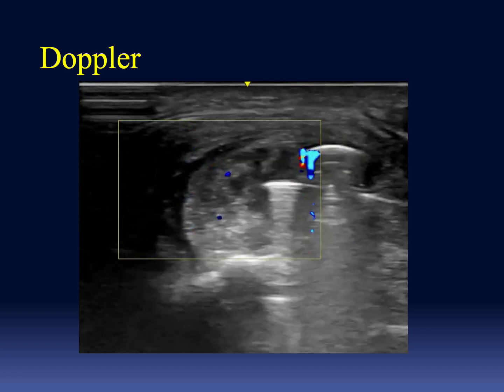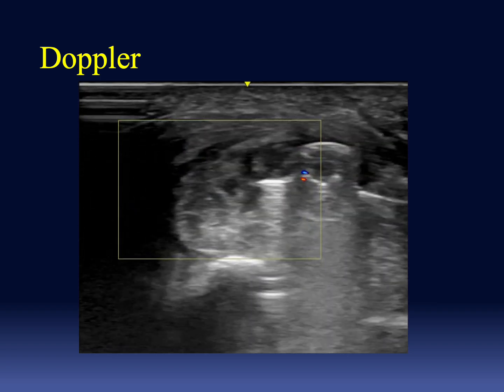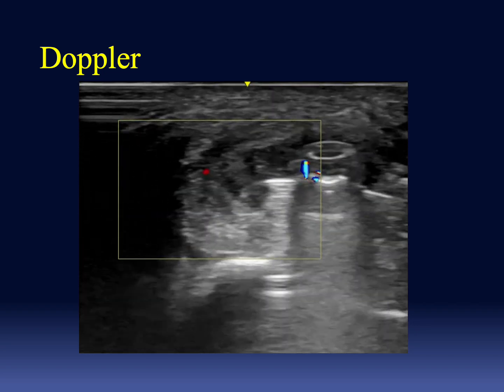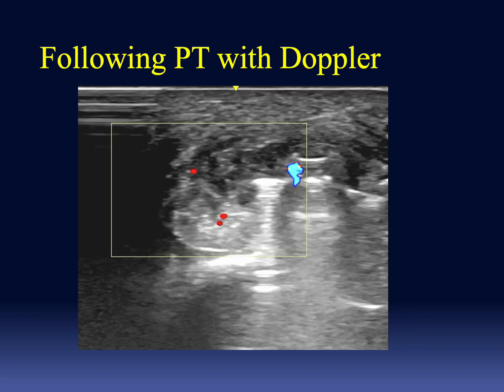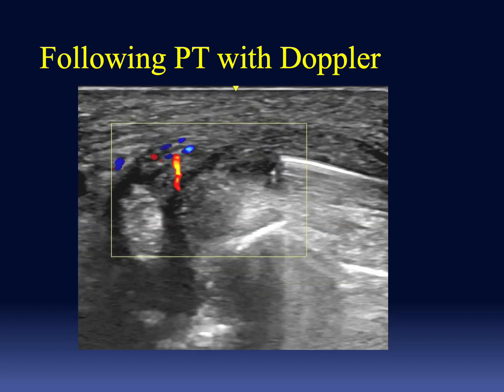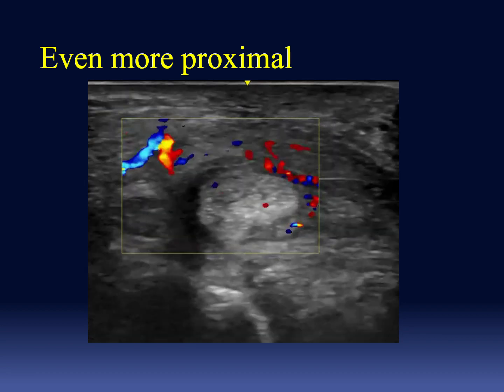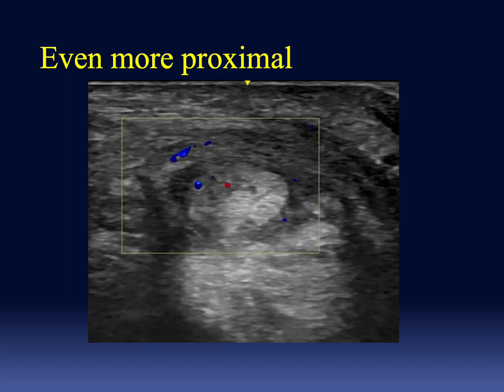Here is a dynamic view with Doppler, and we can see an artifact on the side of the screw, but we see increased circulation within the tendon, indicating a tendinosis, and a deformity of it as the tendon appears to be splitting. If we follow the tendon more proximally, it becomes more echogenic and looks like a normal tendon. And just behind, or to the left, we see the flexor digitorum. And if we go even farther proximally, we see that this is a healthy tendon.